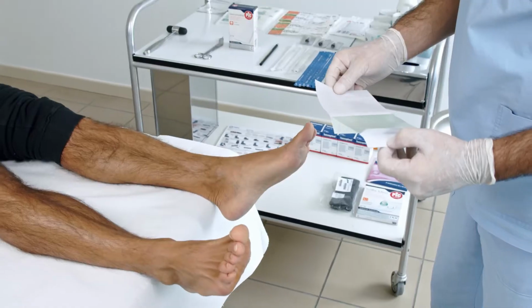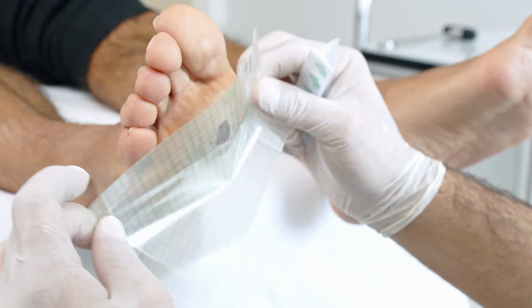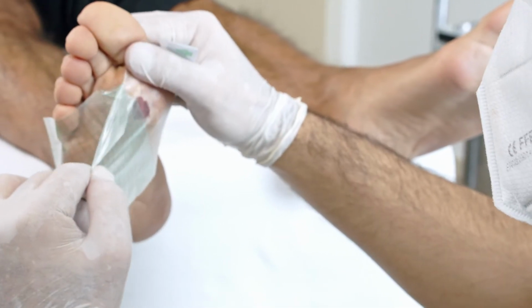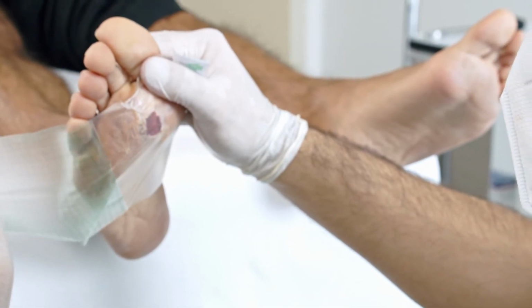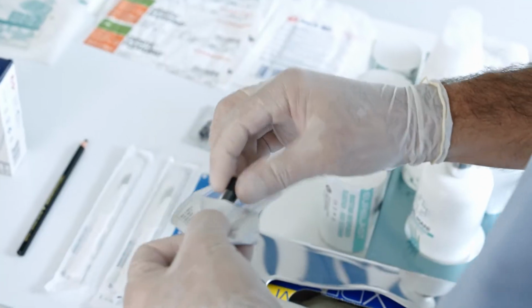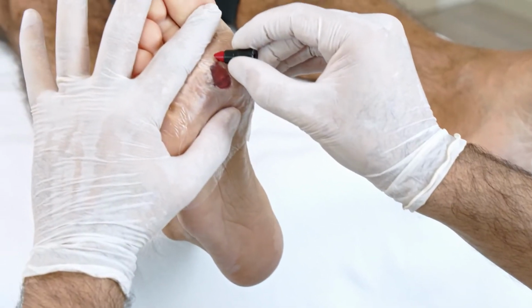To create effective offloading therapy, it is essential to accurately identify the location of the ulcerated area during gait development. For this purpose, we cover the lesion with a transparent sterilized film and we mark the lesion with lipstick or a marker pen.